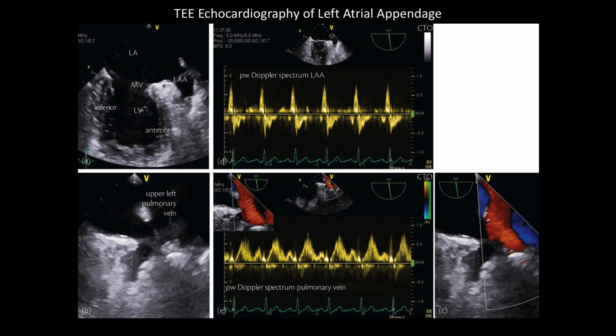The probe itself is probably a centimeter in diameter. You can get a kid's probe that's half a centimeter, but an adult probe is about a centimeter in diameter. You spray the back of the throat of the patient with some kind of numbing agent, right? And then you put that probe down their esophagus, right? So they're essentially swallowing this probe. Not terribly comfortable.